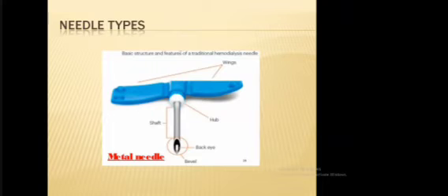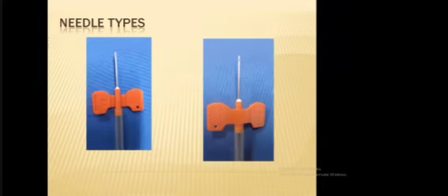Always check the needle. Is there any problem? Any problem with the cutting beveled edges? Is the wing problematic? Does the shaft have any problem? So always check the needle before starting cannulation. It's a commonly used needle.